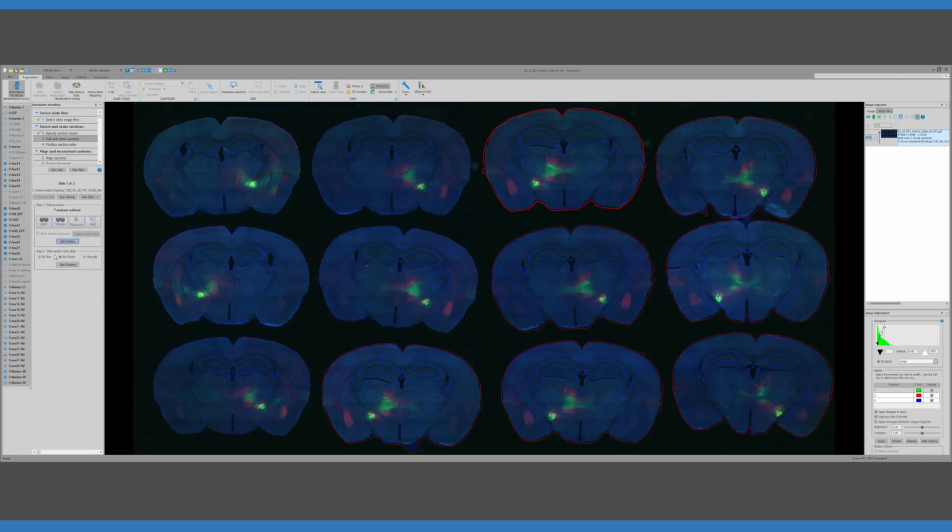And so now we're going to have it order. It's going to order the sections within the slide, starting with the ones that have been selected. So this is selecting the first section. Normally it would have selected this as the first one, but it's selecting this one, and then they're in columns. And so the second section, third section, fourth section, fifth section, sixth section, seventh section. So this is the first on that slide, the 7th on that slide. So then we're done, and we'll go on to the next slide.